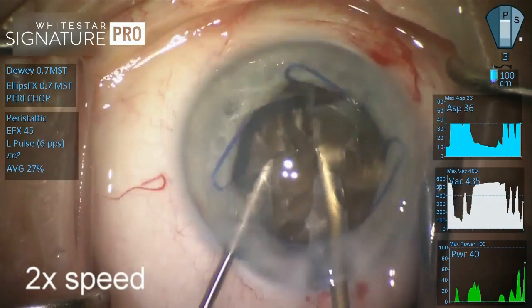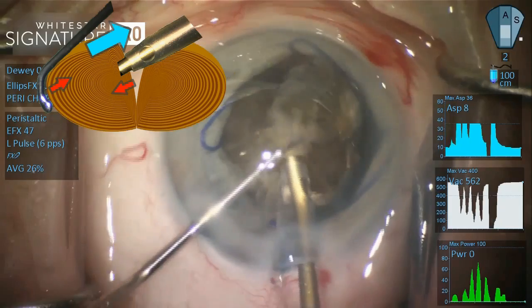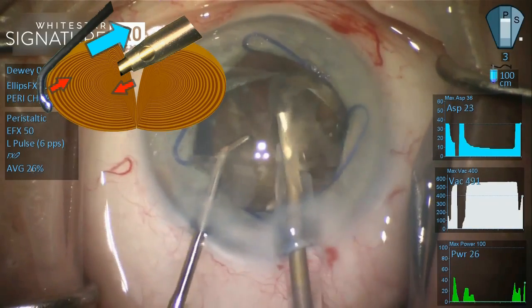And when I say look at the technique, I know how I visualize a horizontal chop. This is how it looks. I wrap the chopper around the equator of the lens, I impale the nucleus with the tip of the needle, and I bring the two instruments together and provide a chop.